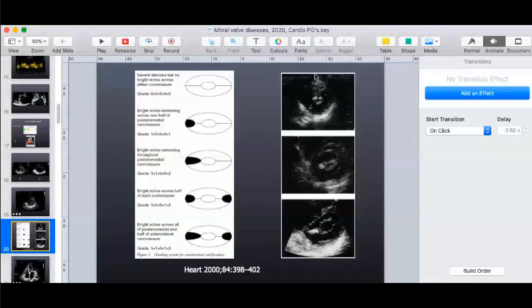Now, what I'm trying to give you is some incremental information: you need to look at the commissural calcification more closely. Look at how much it is affecting the commissure. Is it free of calcium or is there calcium, and which commissure, and if it is there in that commissure, is it the entire commissure or only part of the commissure?